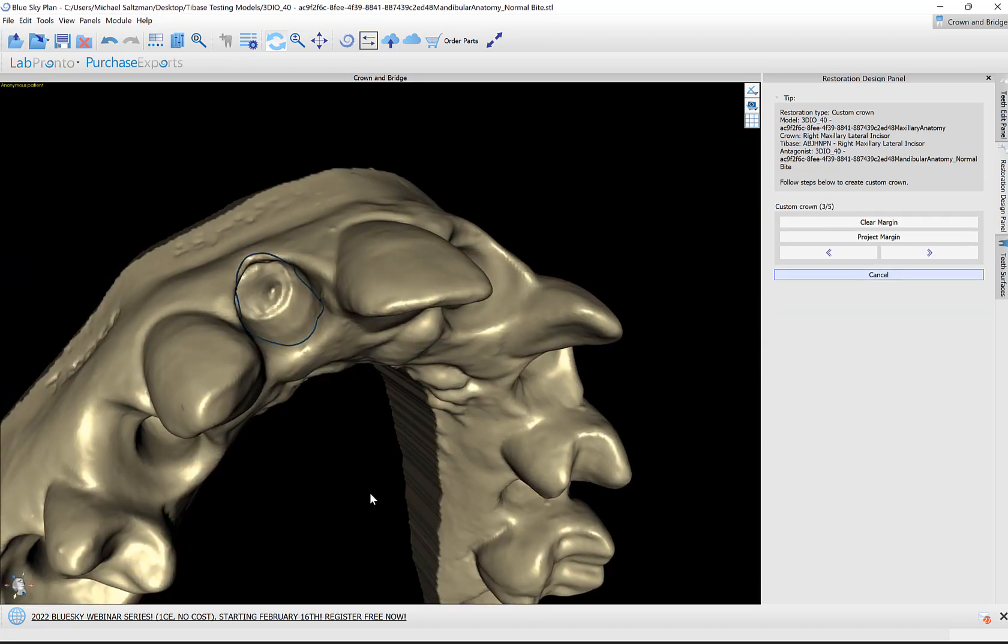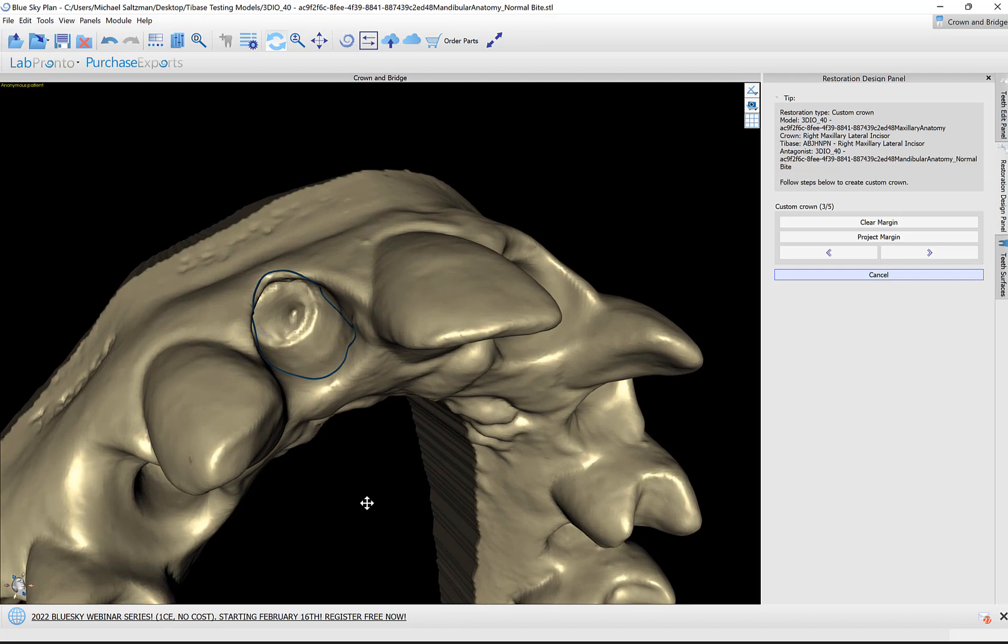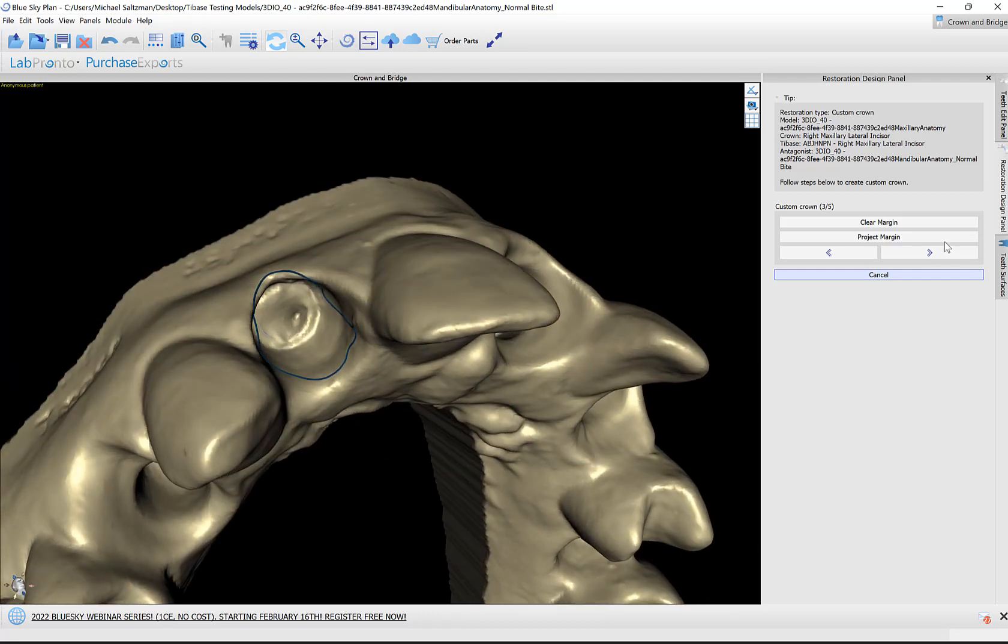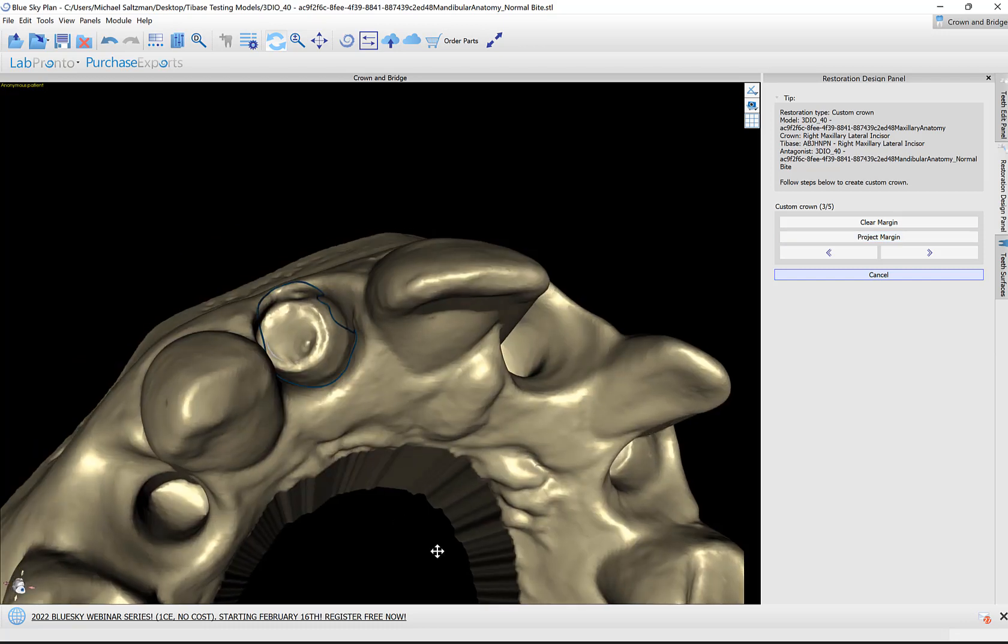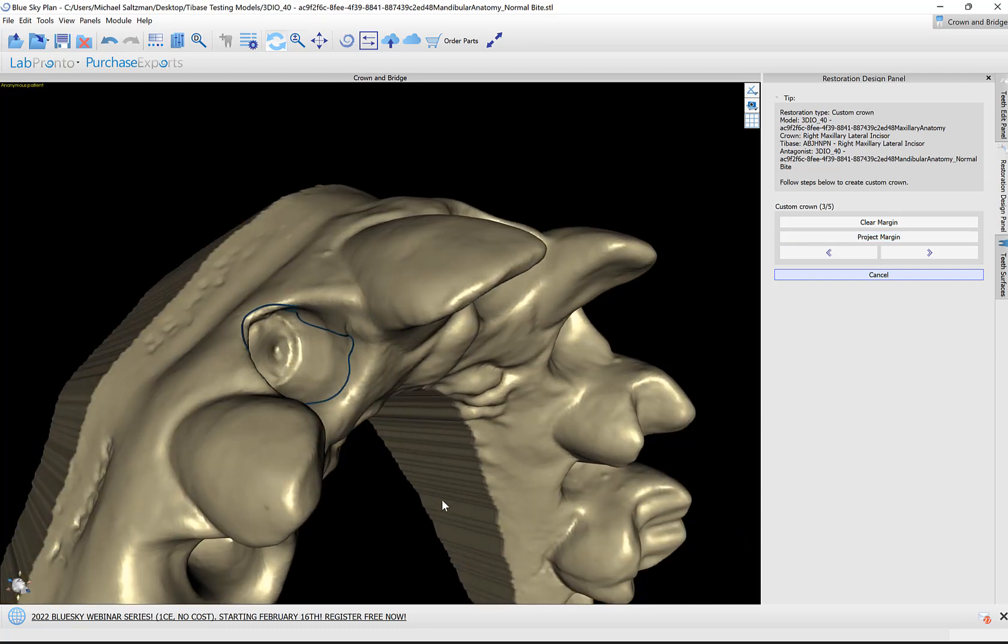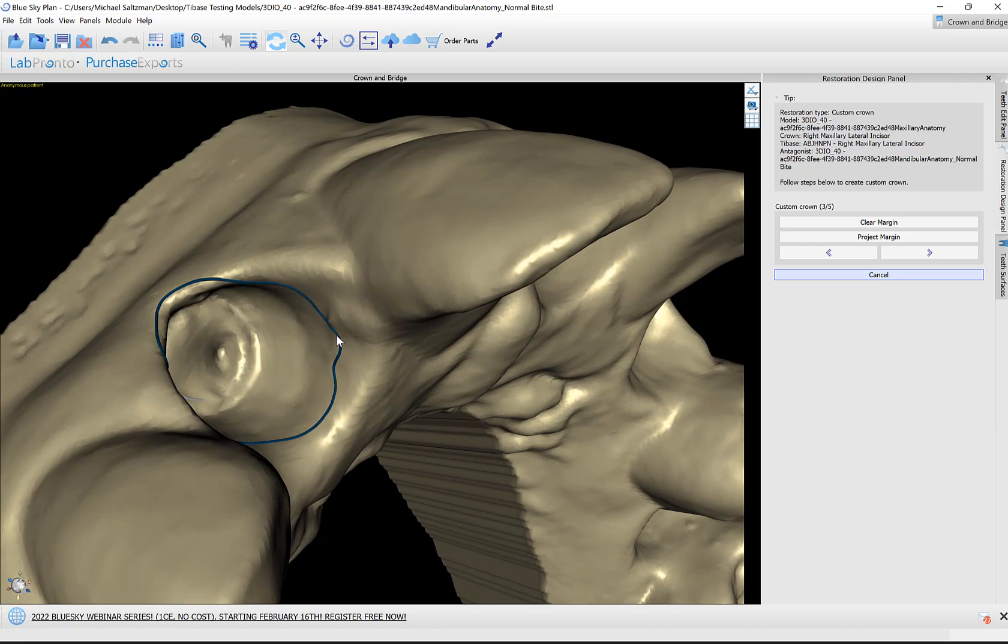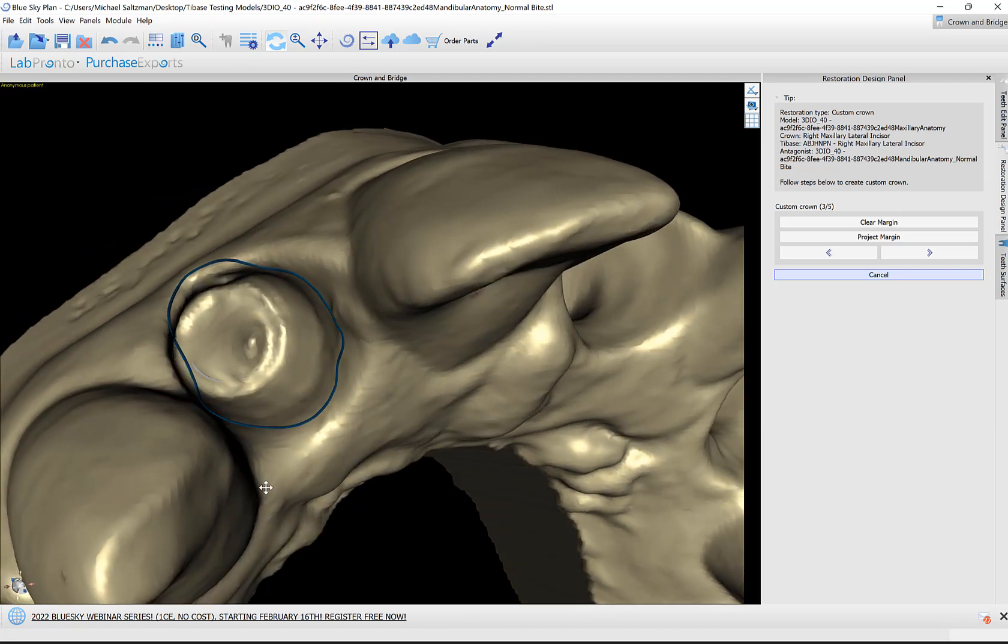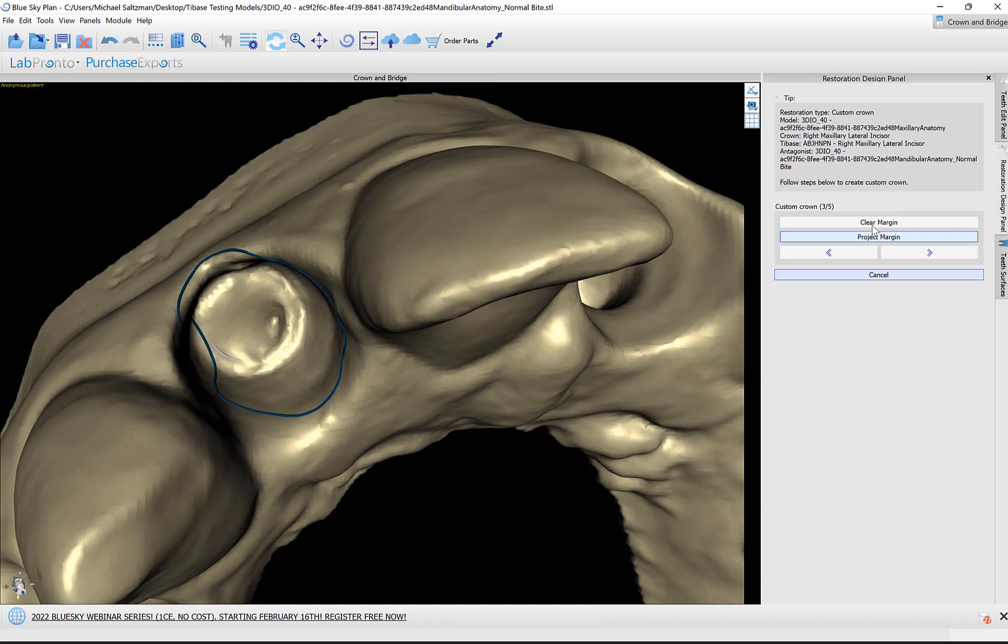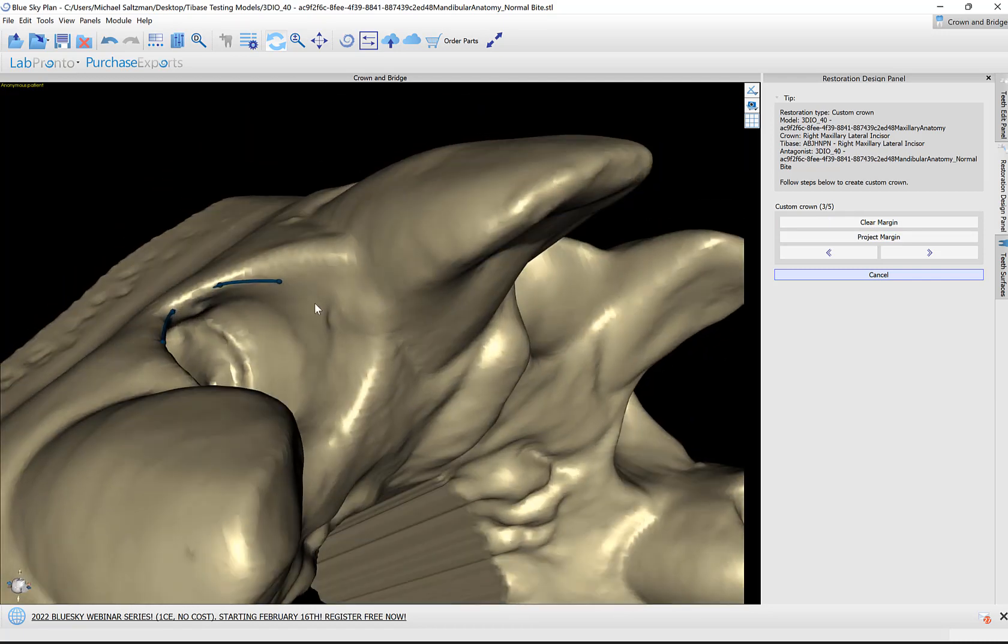The software places an initial suggestion for a margin curve that we could start working with. We could also click 'project margin', which will project the margin based on the size and positioning of the tooth that was placed. If we want to modify and improve this, it's very simple: hold down the shift key and use your left mouse button to just draw that curve how you like it to go. We also have the option to click 'clear margin', hold down the shift key, and place dots along that margin that you like to draw. The software connects the dots and draws the margin curve.